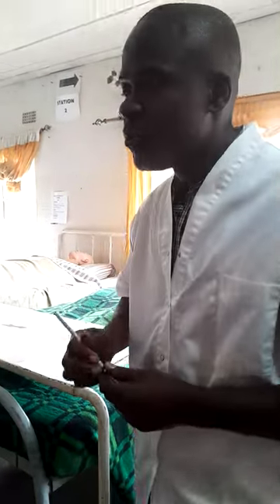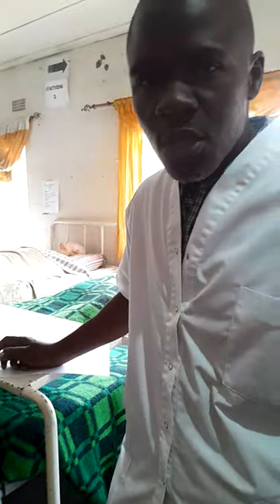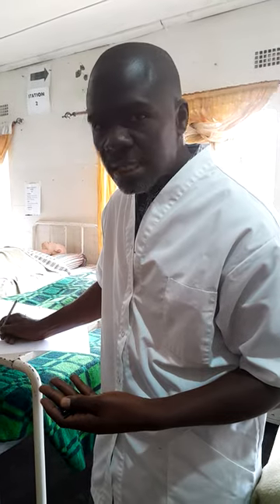Thank you very much, Bridget, for allowing me to do this procedure. After that, you can document. For documentation, you find that you're putting it in the patient's folder. You are required to put the date and time of doing it — so if it's 10 hours, you have to indicate 10 hours. If it's the 16th of October, you have to indicate 16th of October. That's how it should be done.